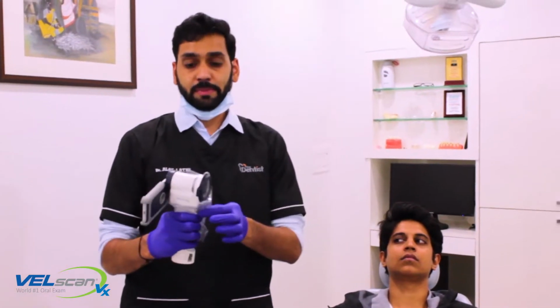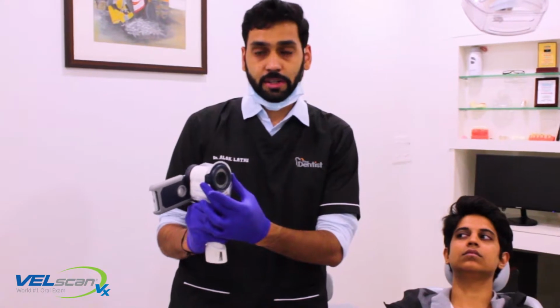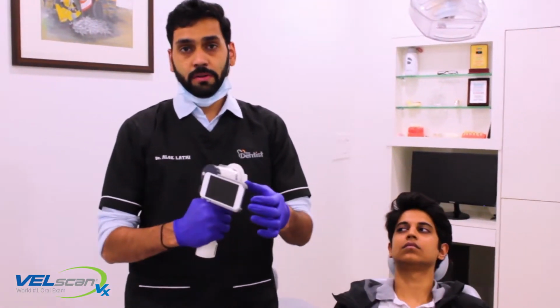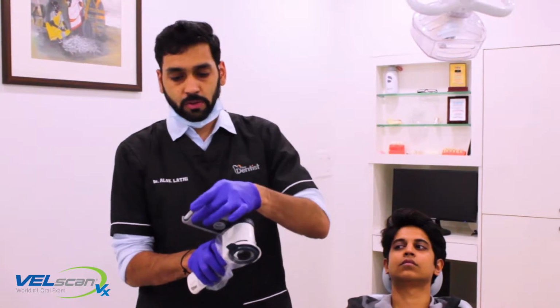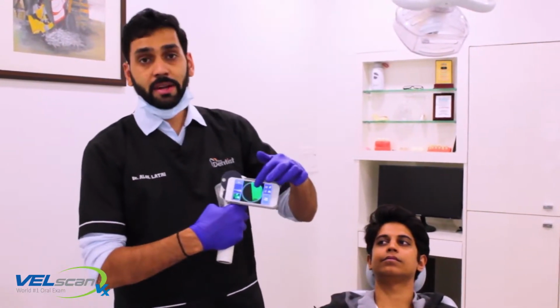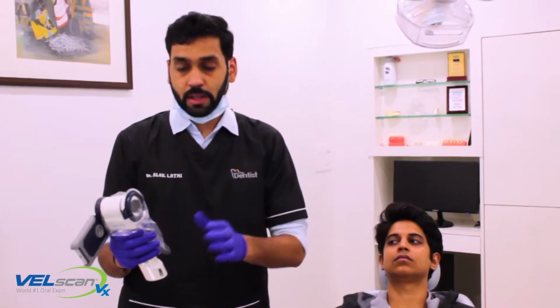The VELscope device basically has a sheath which is attached here, which is changed for every patient. Then we have an iPod which is going to capture the images for us for documentation. So we are just going to start this iPod as well at this point of time. So we are going to collect and document the images from this iPod. The sheath is again a disposable and going to prevent cross contamination for our patients.